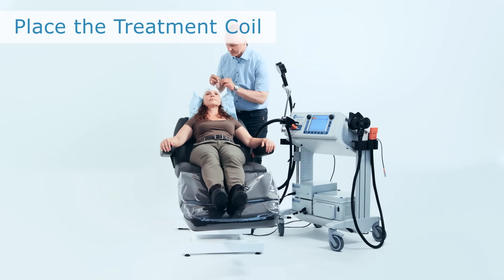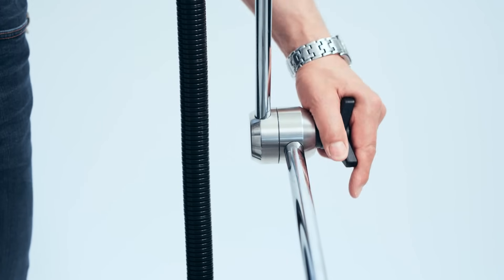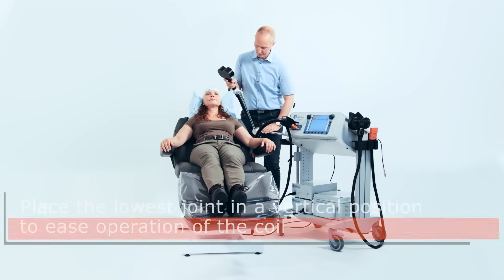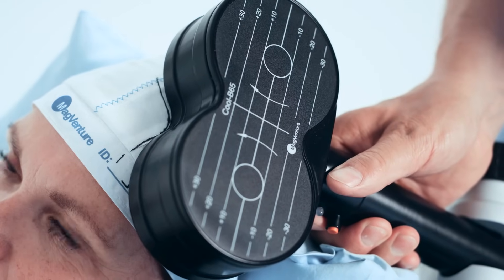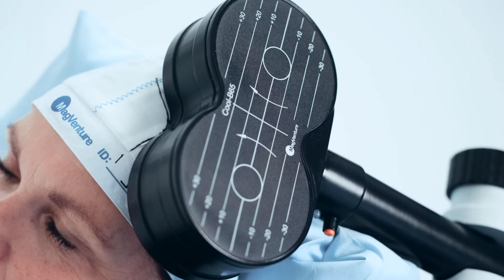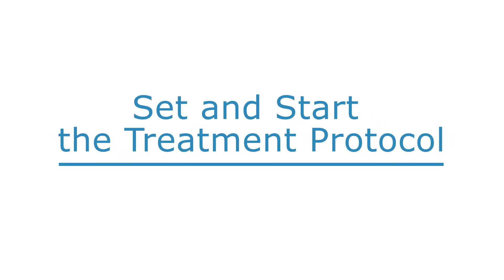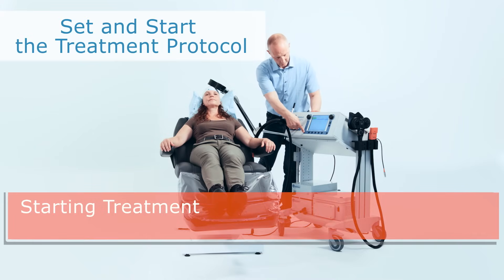Before starting, check that the cap is still in its correct position by checking that the distance from the nasion to the edge of the cap hasn't changed, and that the midline is still centered on the head. Unlock the grip on the center joint of the flex arm to freely move the coil to the treatment spot. It is a good idea to make sure the arm in the lowest joint is placed in a vertical position, which eases the operation of the coil. Align the coil on the treatment location using the contoured line drawn on the cap. The center of the coil should be in good contact with the scalp and placed tangentially to the head. Once the patient is positioned and the treatment coil is placed in the correct location, the operator can start the RTMS treatment protocol.